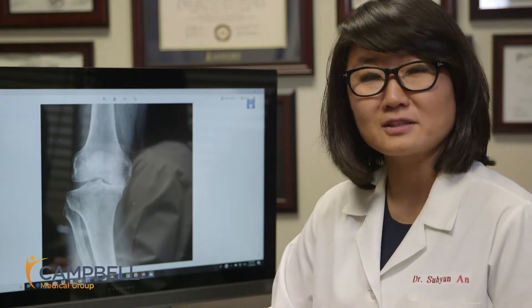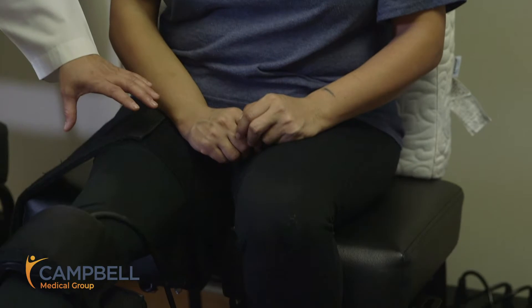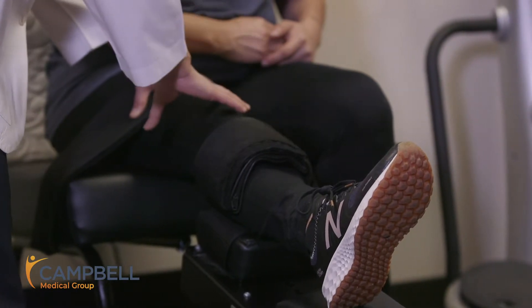Ms. Erika here has volunteered to be our knee model, and right now she's strapped on the knee decompression machine. As you can see, there are two parts to it — one part that holds the upper part of her leg, and the other part that holds the lower part of her knee. The machine is set up for a certain setting for her knee degeneration or knee arthritis.